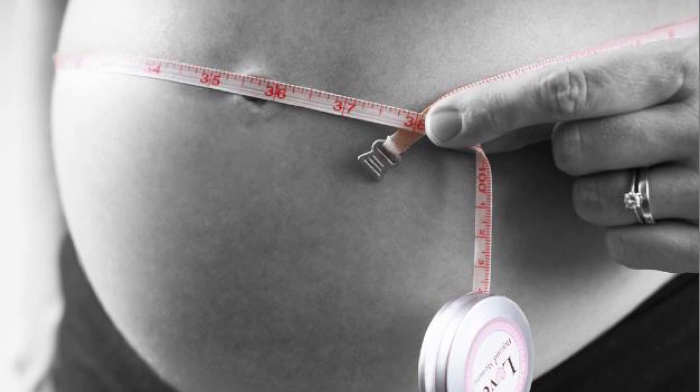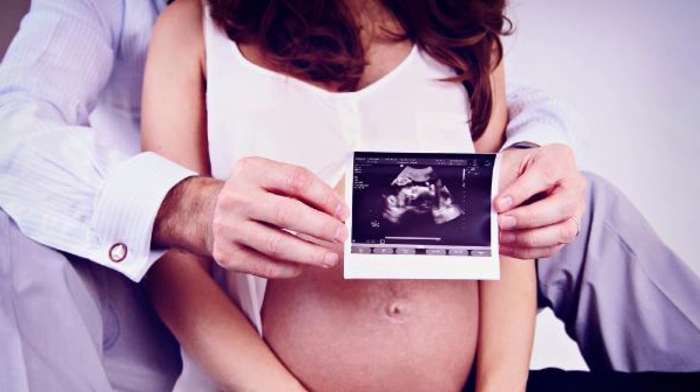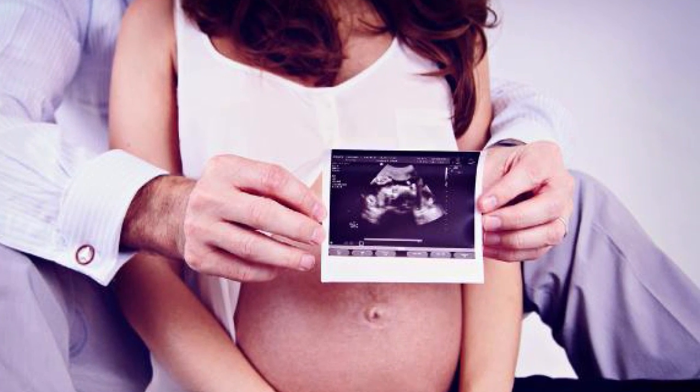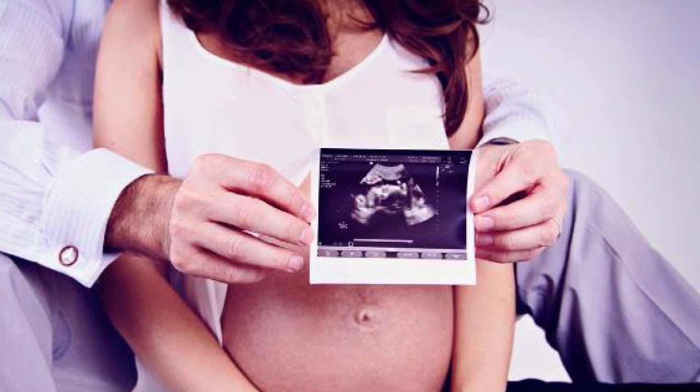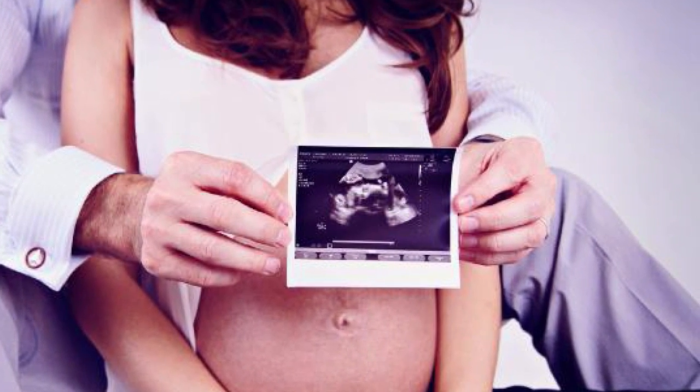This demonstration has been created so you can measure symphysis fundal height as accurately as possible in a reproducible method.